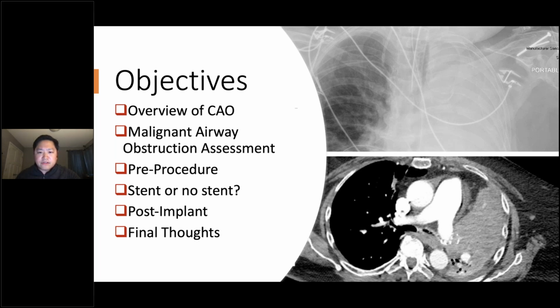So if you look to the right, there's a chest x-ray and there's a CT scan. I'm going to begin the talk with a very brief clinical presentation of a patient in her early 60s with COPD, who, as you can see, has an endotracheal tube for acute respiratory failure. You can see the left side of the chest has a whiteout or opacity. And the correlate CT scan shows a really sizable left upper lobe mass with obstruction of the left main.